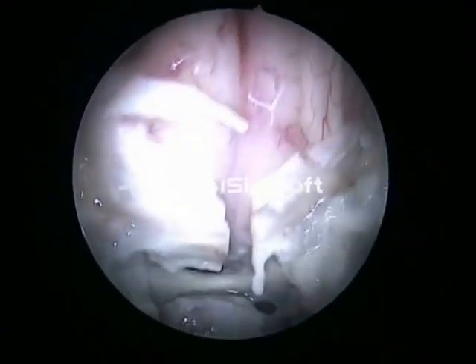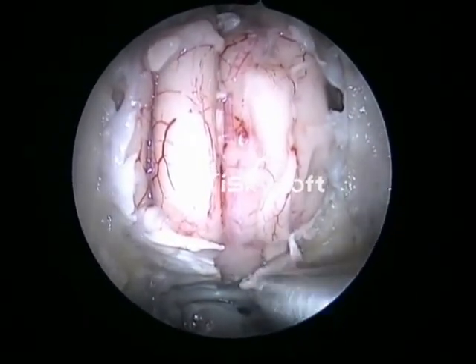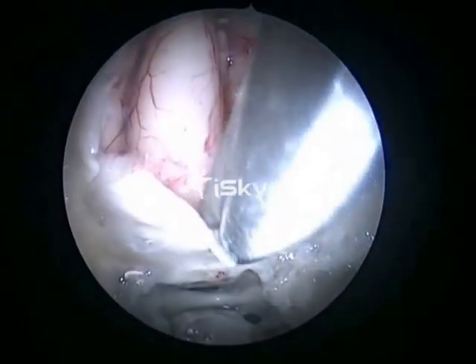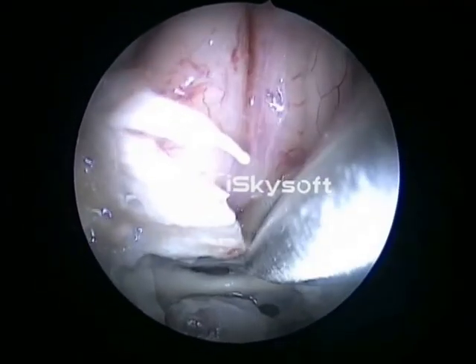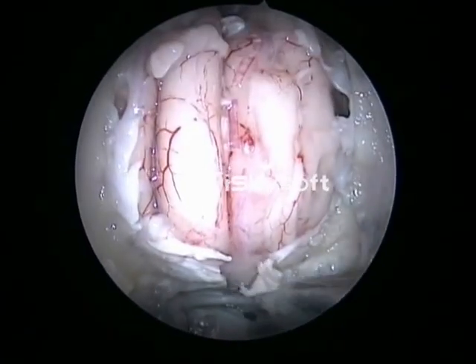Now the dura is being reflected over the orbital apex on both sides. A clear view of the olfactory bulb is seen. Dura is being reflected on the orbital apex.